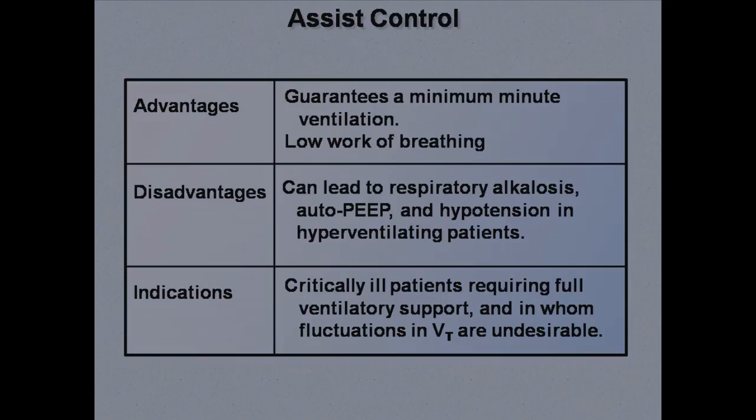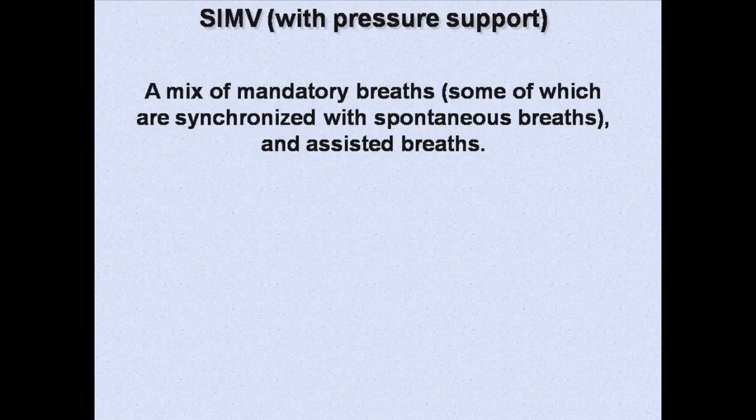Let's now talk about SIMV. Although SIMV can be used without pressure support, it is very rarely done, so the following will assume that pressure support is being used. SIMV is a mix of mandatory breaths, some of which are synchronized with spontaneous breaths, and assisted breaths.